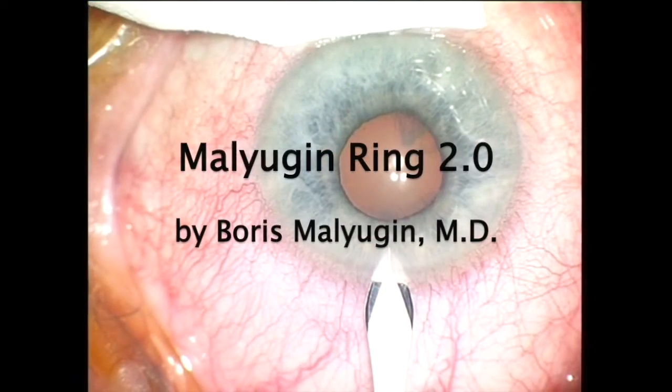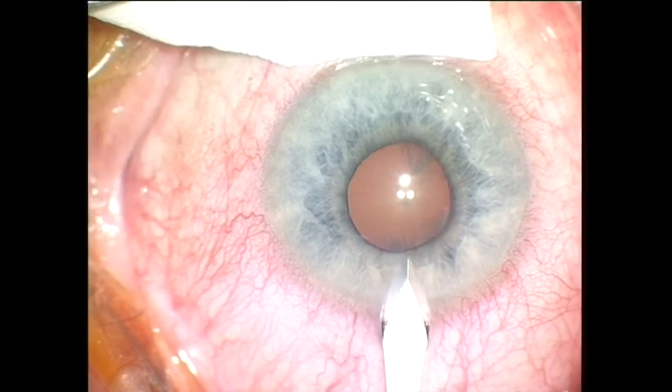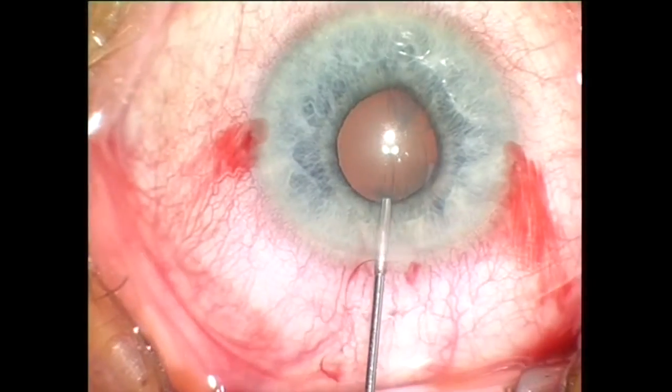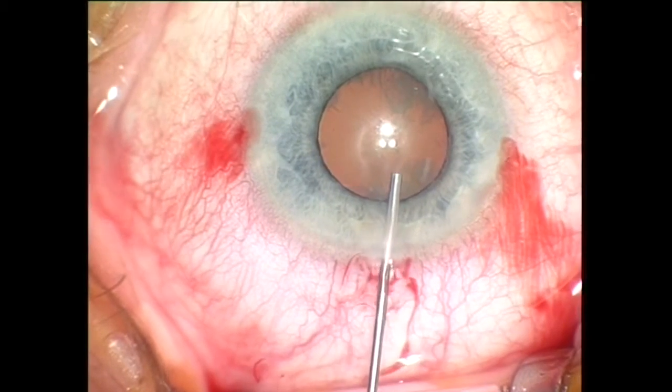The new generation of the Malugin ring is specifically designed to be implanted through a 2.0 mm incision. Prior to implantation, viscoelastic is injected into the anterior chamber and under the iris.